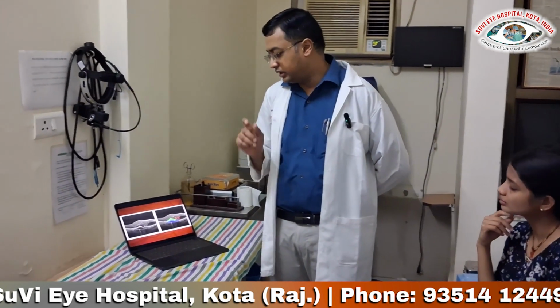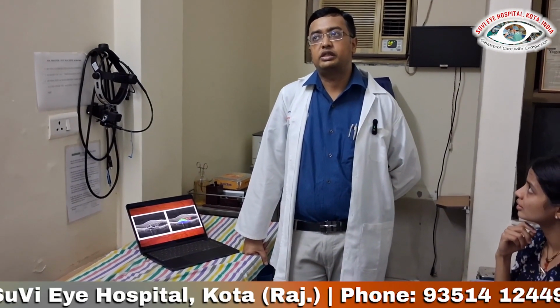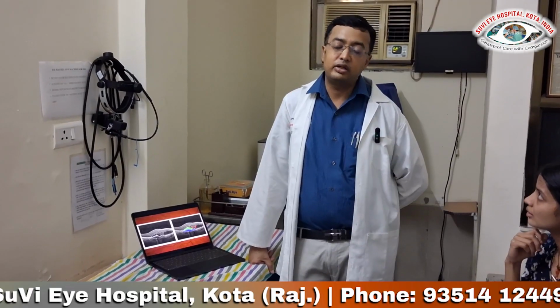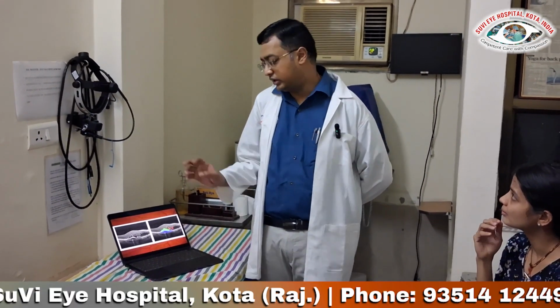So suppose, I'm shifting a little bit out of hyperreflective foci. What are hyperreflective foci, and how do we differentiate? Suppose sometimes CNVM also has hard exudates, even in DME or vein occlusion, particularly in DME, if we have hard exudates. So how do we differentiate between hyperreflective foci and hard exudates?